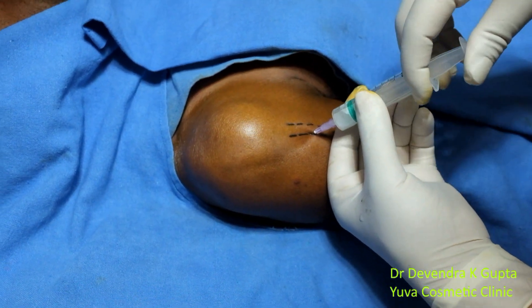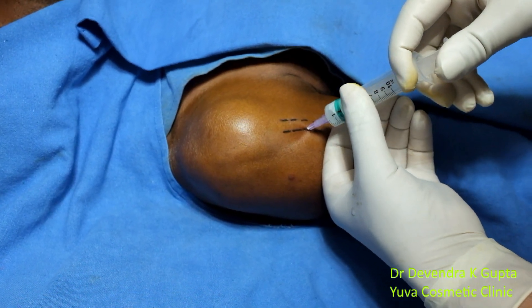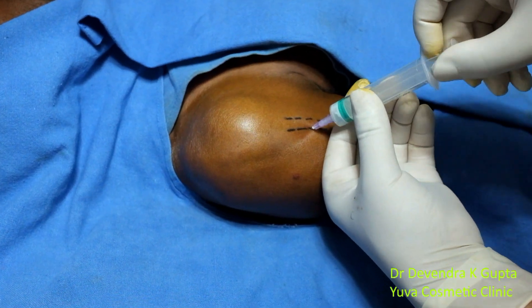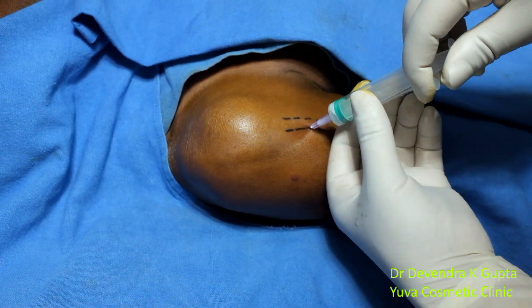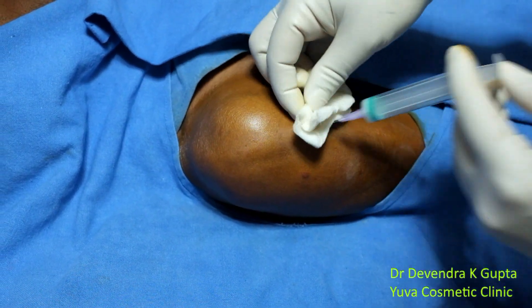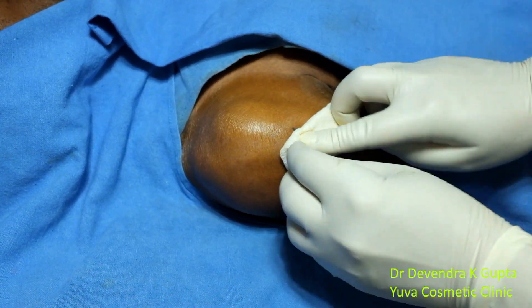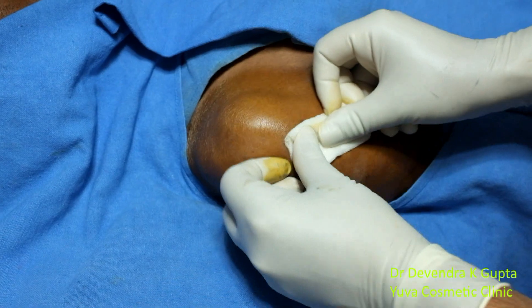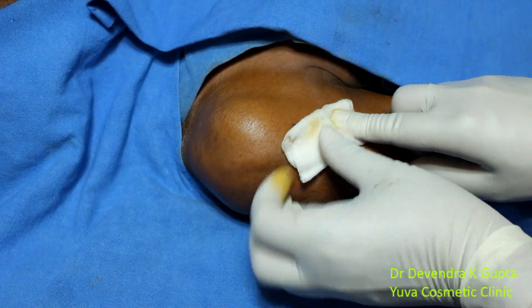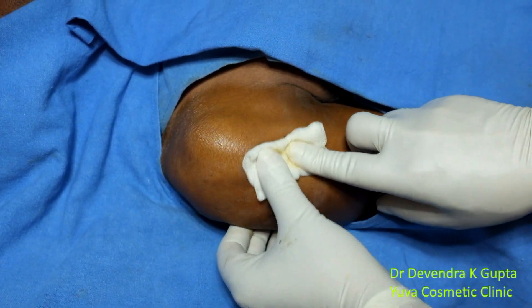Without moving the tip of the needle, I have injected 5 ml of the solution that contains 30 mg of depomedrol. Just remove it and massage the area. I have not given the injection in the tendon itself — if you give the injection in the tendon, there are more chances that it will rupture in due course of time.